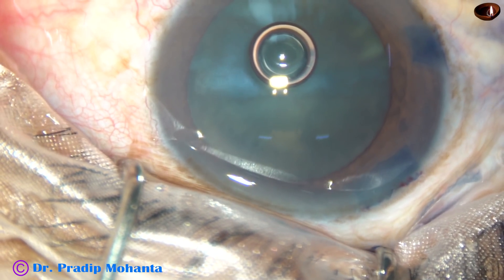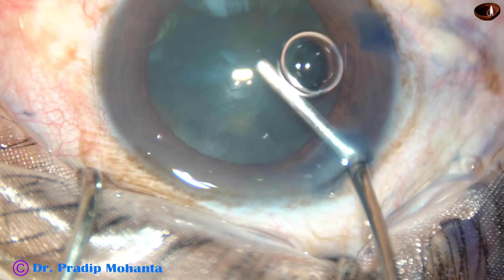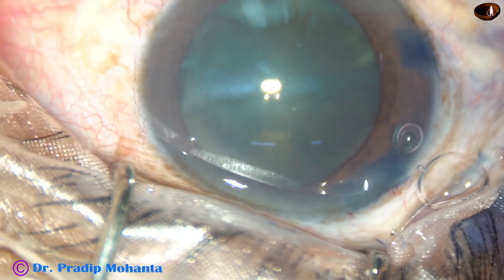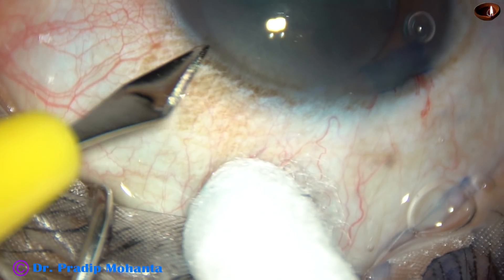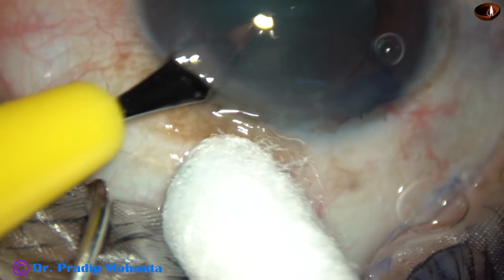2% hydroxypropylmethylcellulose is being injected to fill the anterior chamber. And then one more side port — one more paracentesis is made on the left side of the main incision.